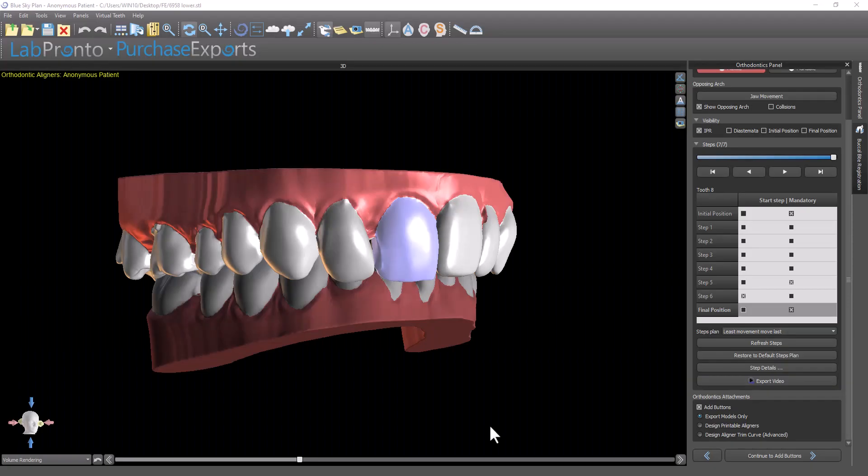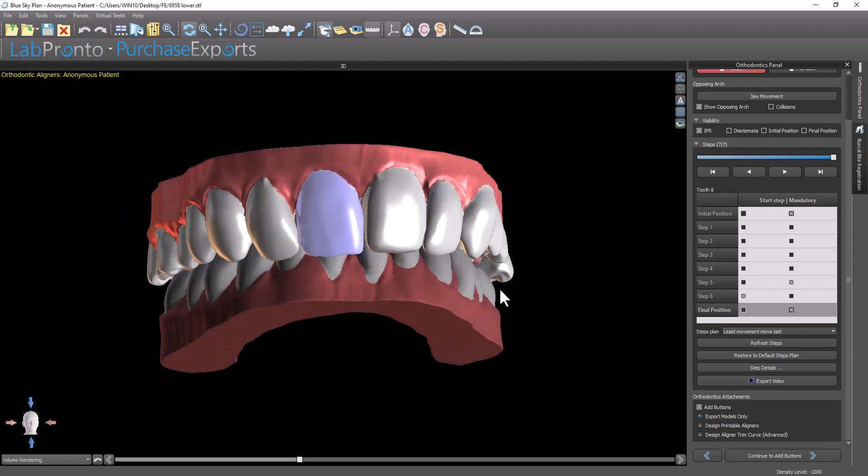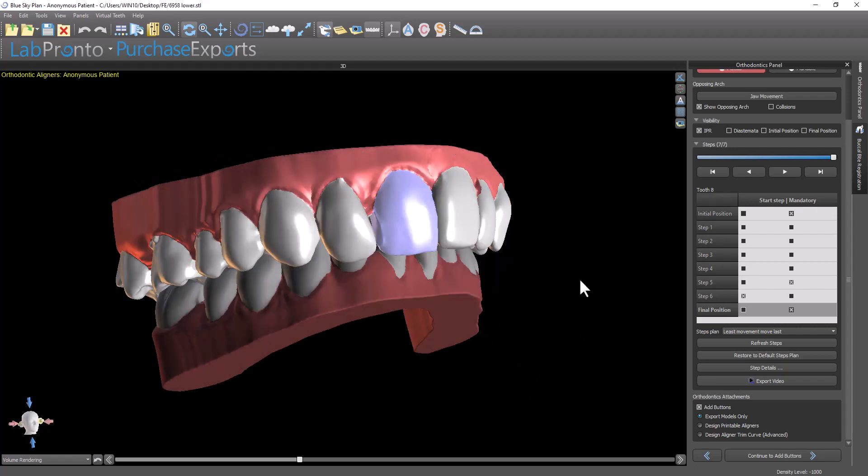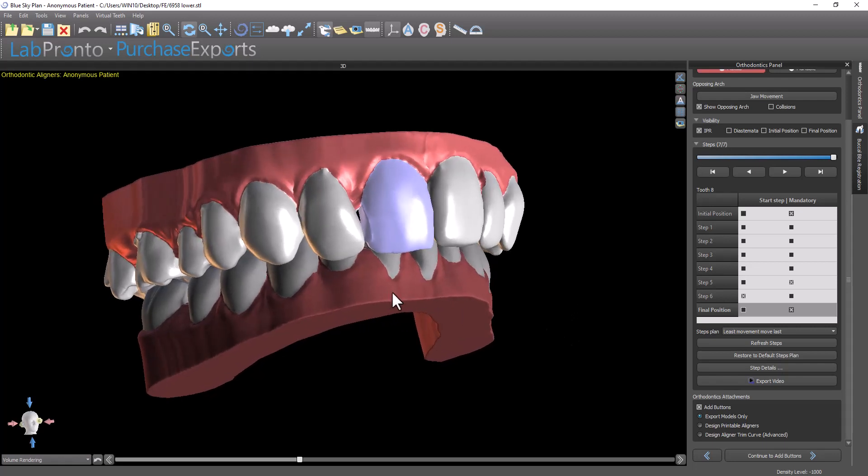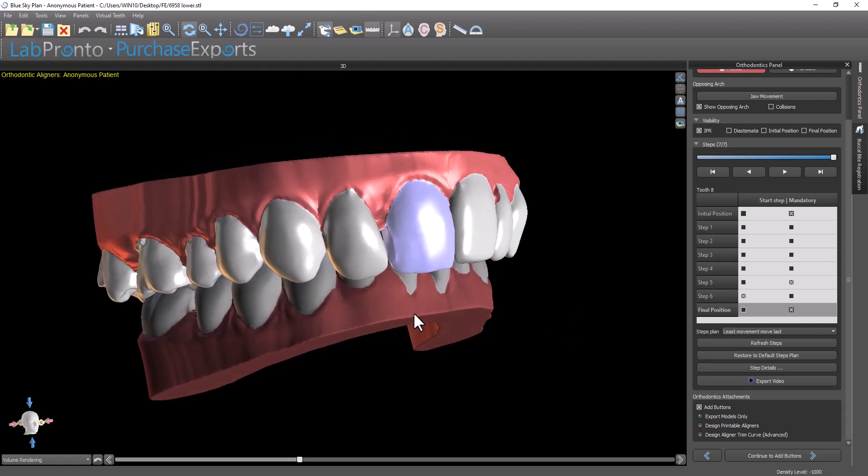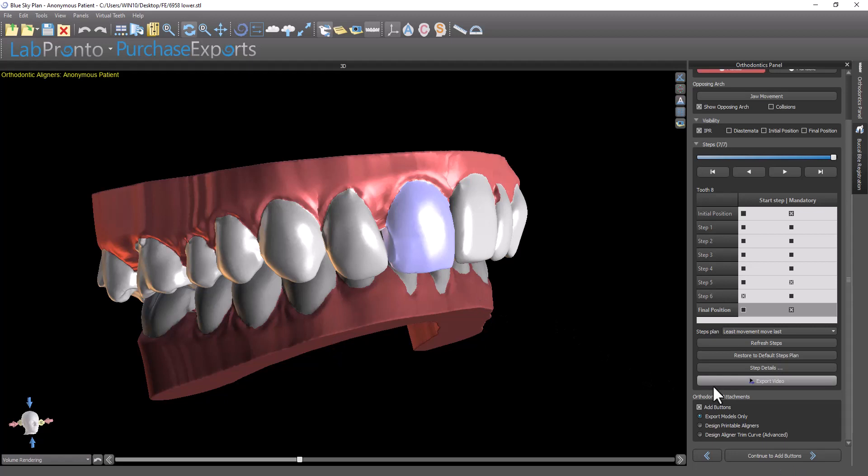Blue Sky Plan now contains the functionality to automatically add buttons to the orthodontics digital tooth setup. I'll show you how to do that in this video. We're at the stage where I've already snapped the teeth to the curve, confirmed the tooth placement, and now I'm at the step where I can choose what to do next.